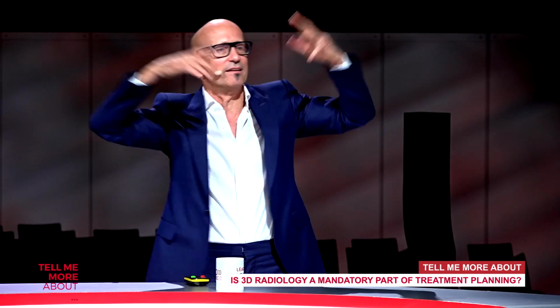So, you know, when I have a single loss of a tooth, then I have the neighboring teeth, I have the buccal-lingual reference. So I'm going to place this, and I have maybe only a panoramic view. I know how much bone is there. So I can place an 8 millimeter, 9 millimeter implant easily in the right inclination. I have all the help there. I can do that for sure. And there are many who can do that. Exactly. And there it doesn't make sense now to do a 3D analysis. Yeah, I would agree with everybody.